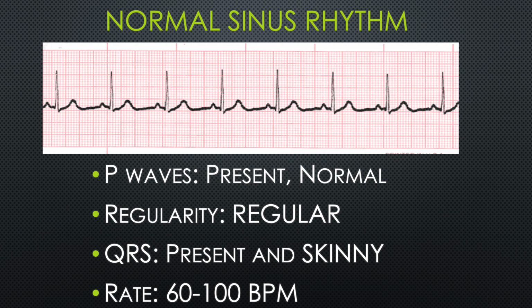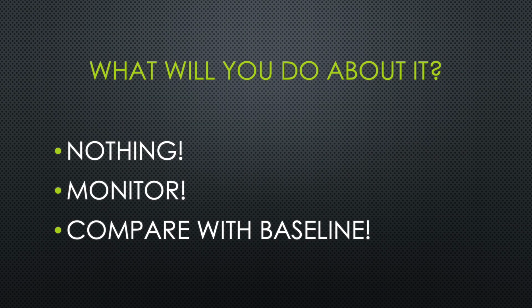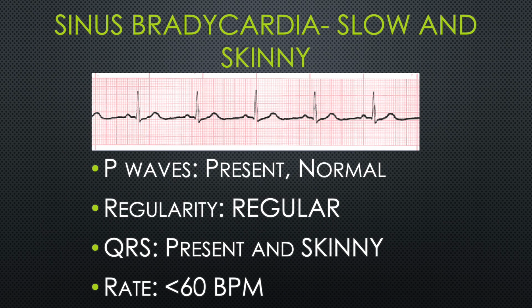So let's see what we would do about normal sinus rhythm. So what are we going to do about it? Well, nothing. We're going to monitor this patient, maybe compare it with their baseline, see what their normal heart rate or rhythm is, but we're just going to watch them because there's nothing abnormal about this rhythm. There's nothing to treat. So let's start looking into some abnormals.